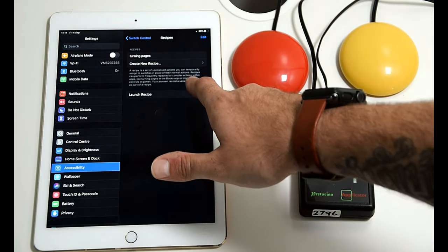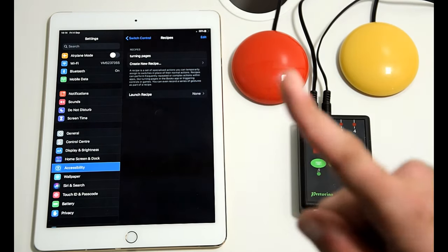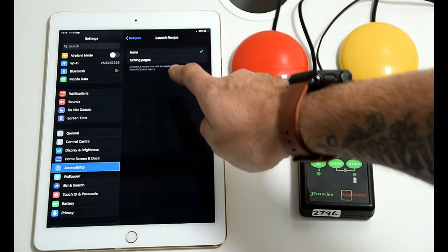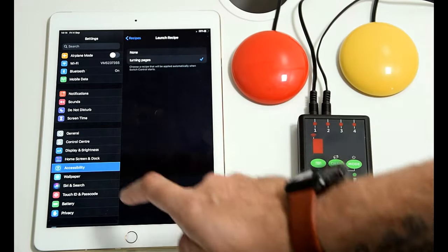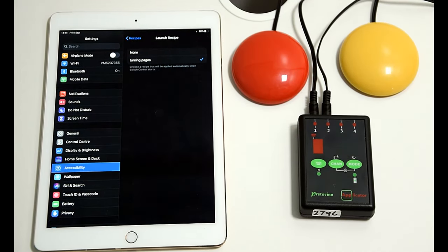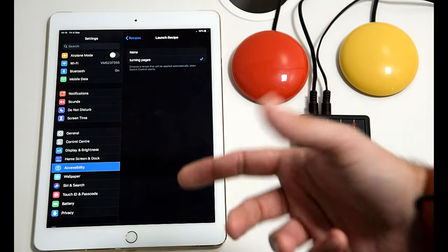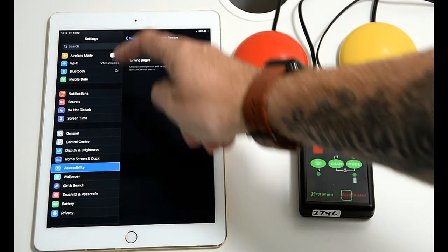Come out of recipes and then this final bit is crucial. You have to set it up to launch the recipe. So you go into launch recipe and select the recipes you've built in there.